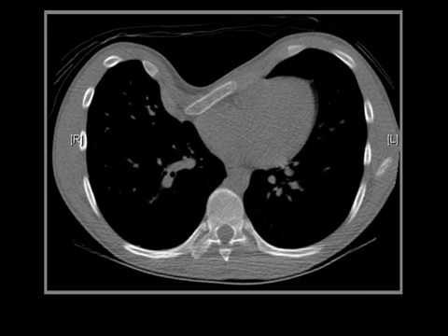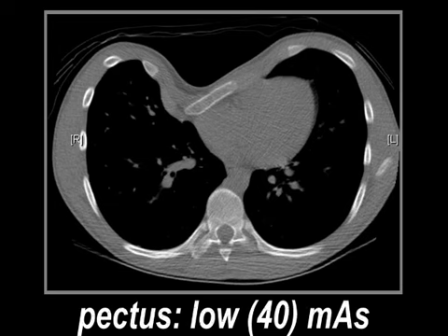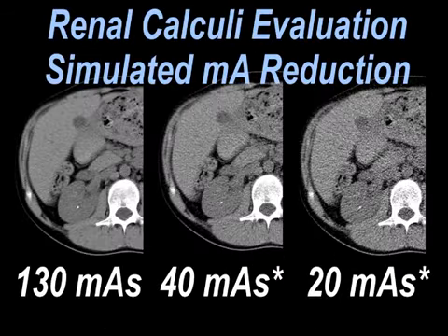And what we need to do is to sort of determine what the dimensions are here, AP versus medial lateral. But you can see this is a very low dose, very, very noisy examination where 40 mAs was used. And this is probably in the order of dozens of chest x-rays rather than hundreds or so.